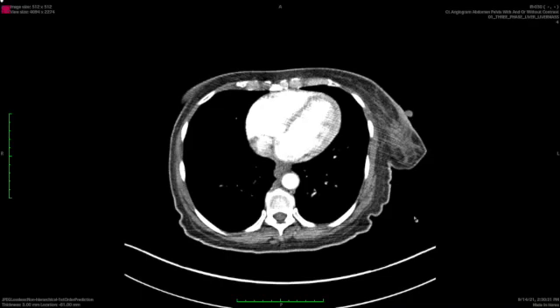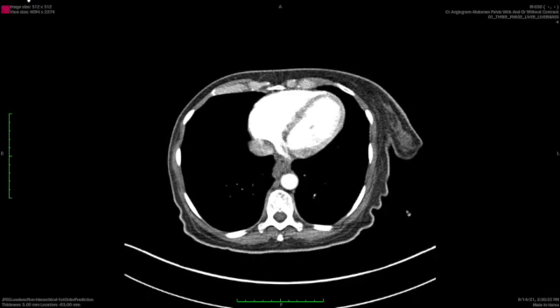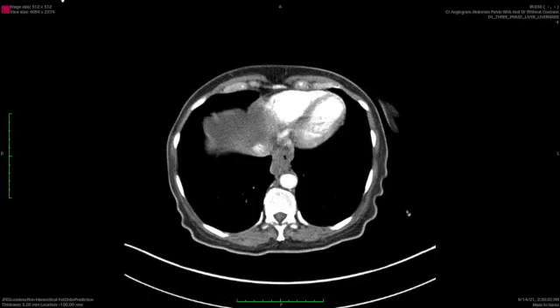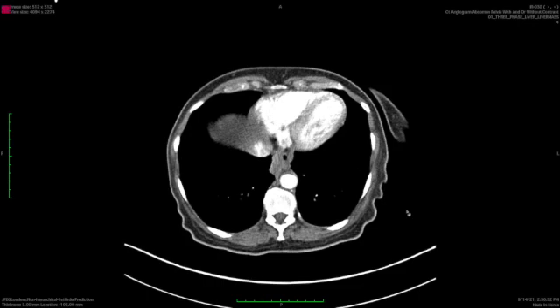Hello, it's John Guinan with Interventional Radiology again, and we're going to talk through this fairly complex case of symptomatic portal hypertension in a patient with hepatic cirrhosis. This was a lady who was coming in needing large volume paracentesis, also had a history of esophageal variceal bleeding, and so they were looking for treatment for both of those things.